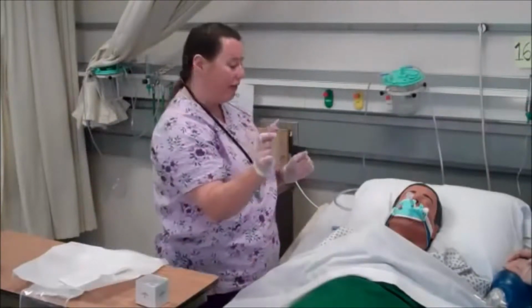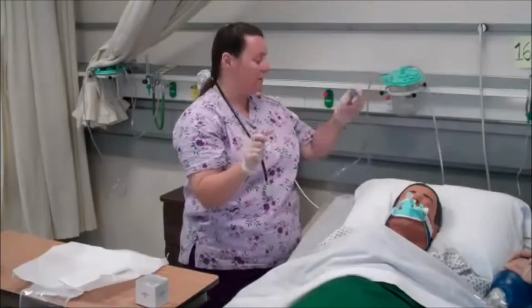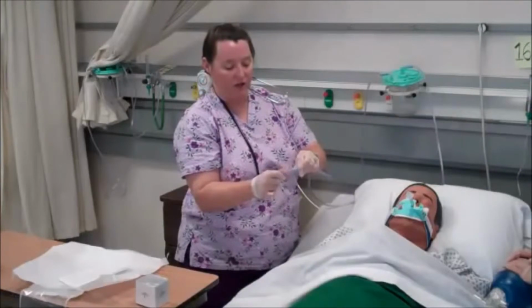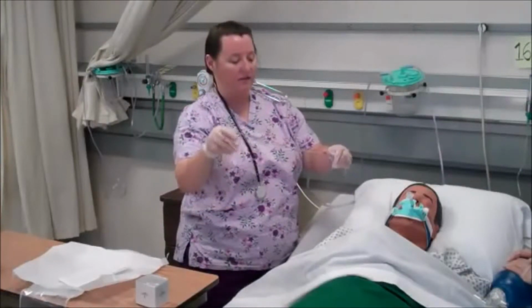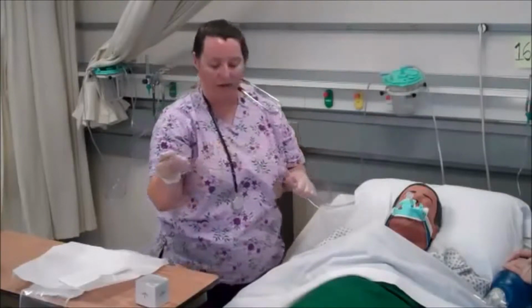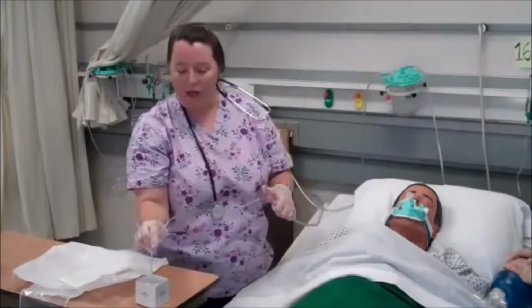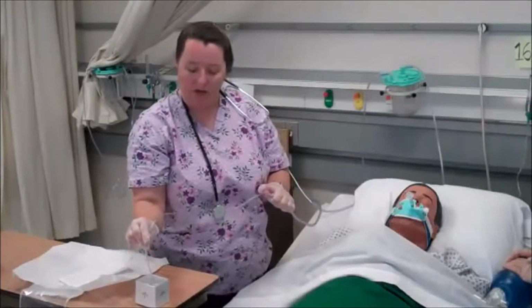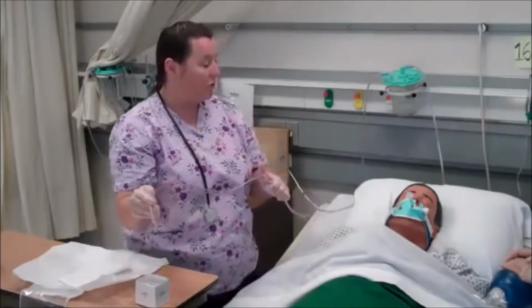I'm going to take my catheter here and attach it to my vacuum source. I'm going to attach the two connectors together. Again, this is still sterile. This is now clean. My hand can go over the top here. Left hand is now clean only. I'm going to test my vacuum source here, to make sure that the vacuum source is working appropriately.